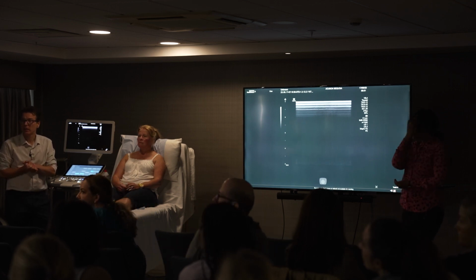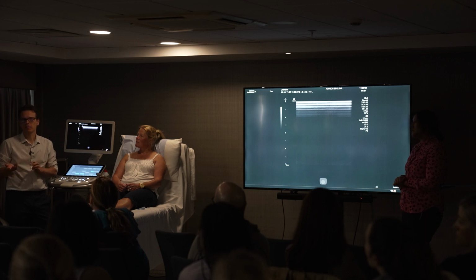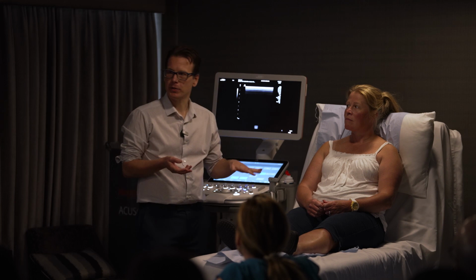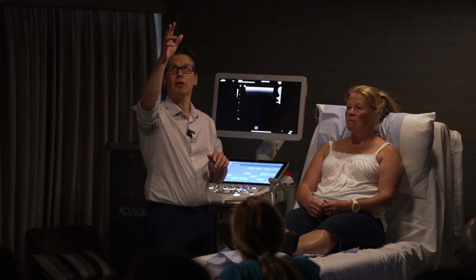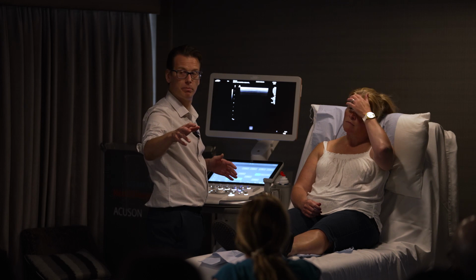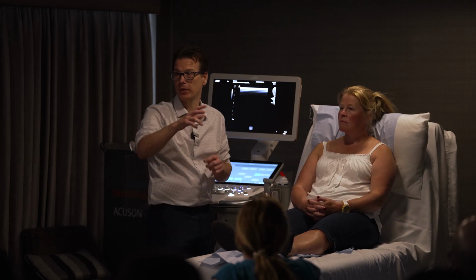Are you prone to upper limb problems? So I have some sonographic colleagues who have shoulder issues, but that's why you want to adjust the patient to make sure you prevent those, and making sure that you're not scanning up like this or leaning forwards, that you have pretty much a neutral body position. But obviously you do put pressure on your shoulder, repetitive strain.